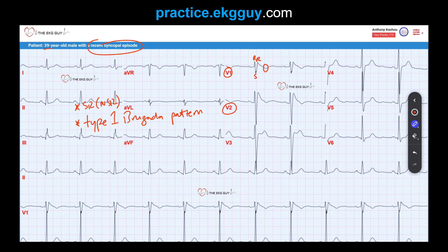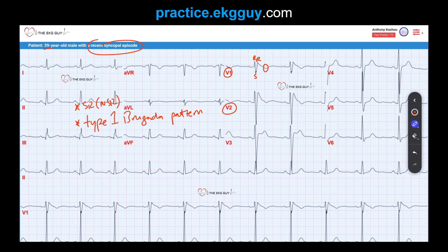Think about this: a 39-year-old male, perhaps otherwise healthy, with a recent syncopal episode — you don't want to miss this. Brugada syndrome is commonly associated with a genetic mutation, the SCN5A gene, which affects sodium channels in the myocyte's cell membrane. Identification of these Brugada ECG patterns, as well as evaluation of the patient's clinical and family history, are critical for making the diagnosis, as these patients are at risk for life-threatening ventricular arrhythmias and even sudden cardiac death, while they may otherwise appear healthy and normal.